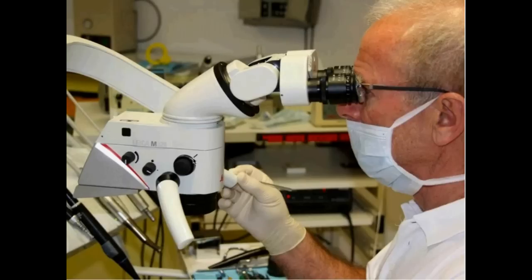Okay. Yeah, I think this question was mainly regarding maintenance, and so this answer with the service already answers the question. Regarding calibration, from my perspective, if you're working with a microscope with integrated camera, there is a possibility to do white setup calibration, and this is actually all you need, and this is not a problem with the integrated camera.